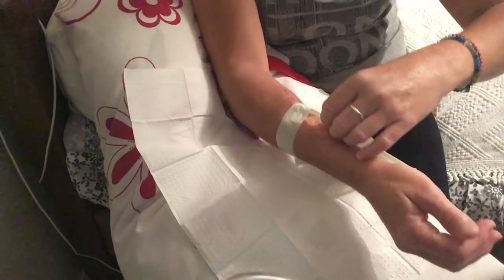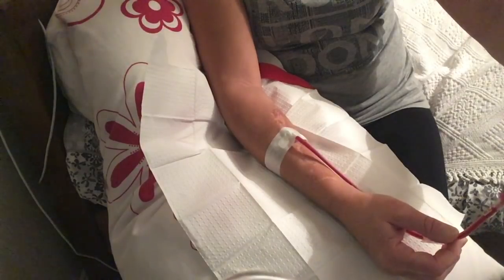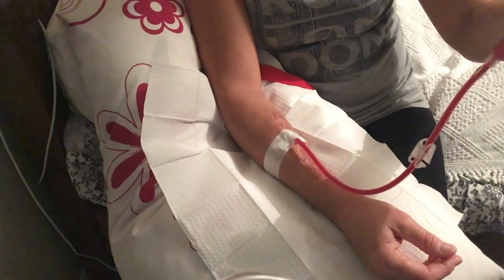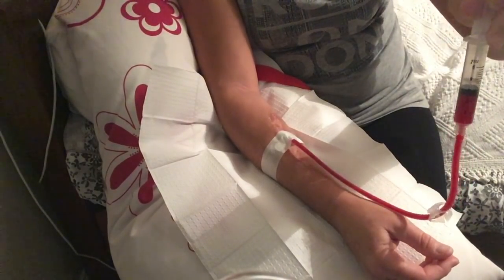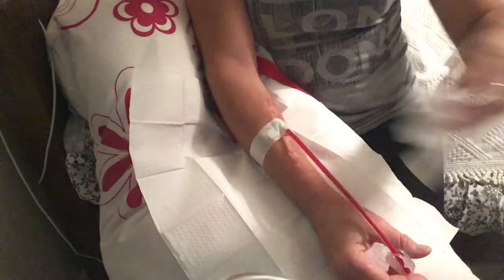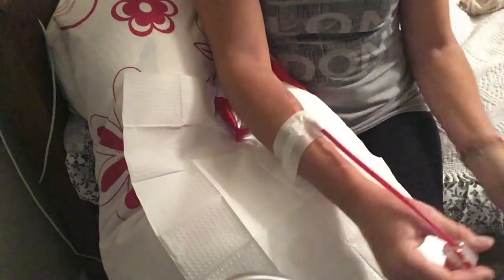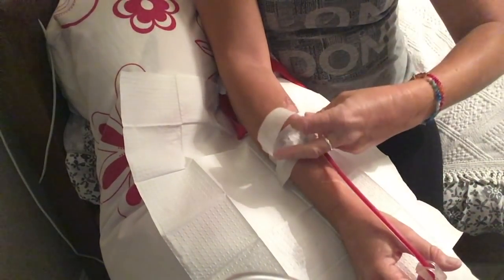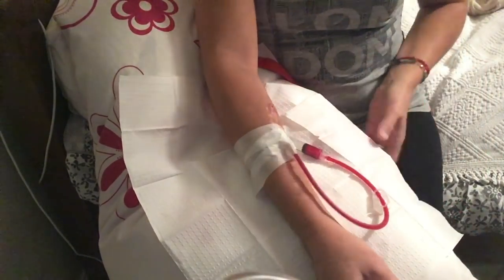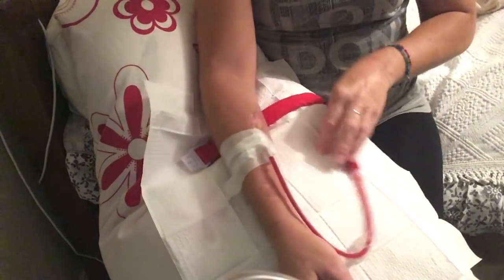I've already laid out tape, so I just tape the first piece over the wings of the needle to secure it. Then I check that it's drawing blood out — that's fine. I use the syringe already on the end to flush it and make sure it's flowing, which is fine. Then I use another piece of tape over the first section of tubing, and a third piece over the needle part where it enters the skin. That's pretty securely taped down.